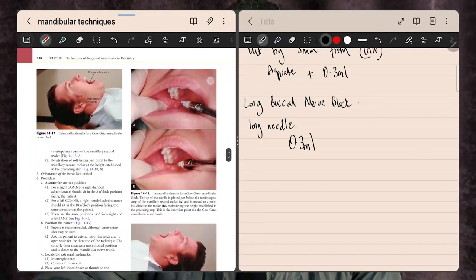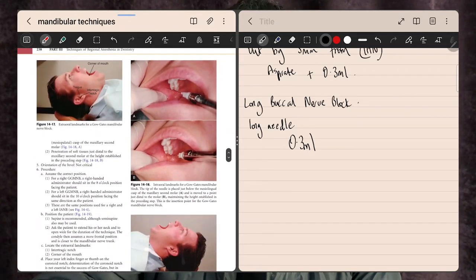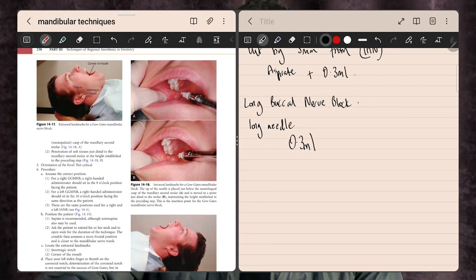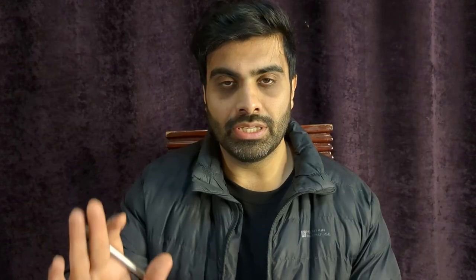Again, we're coming in from the opposite side with a long needle, looking to get to that condylar neck region — quite high up. The patient is supine, directing towards that last upper molar, looking to contact that condylar neck region to inject the site.